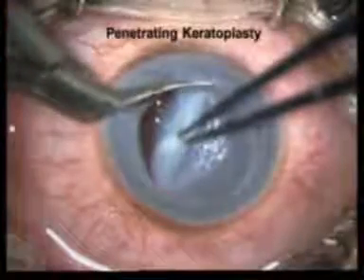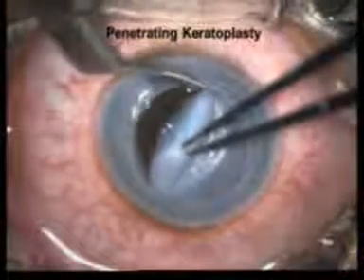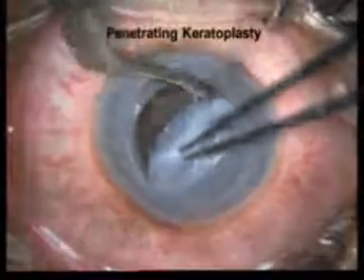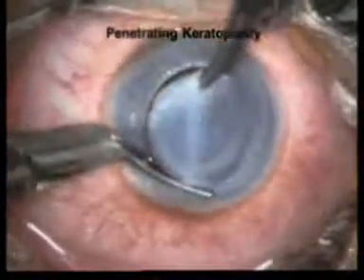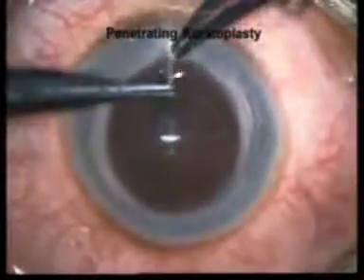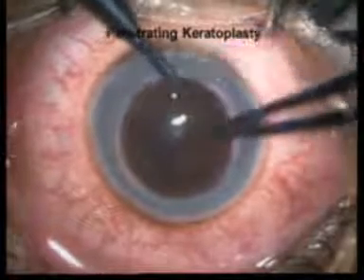Penetrating keratoplasty, the traditional surgical modality of replacing a circular button of full thickness cornea with a donor button of similar size, needlessly sacrifices healthy endothelium.